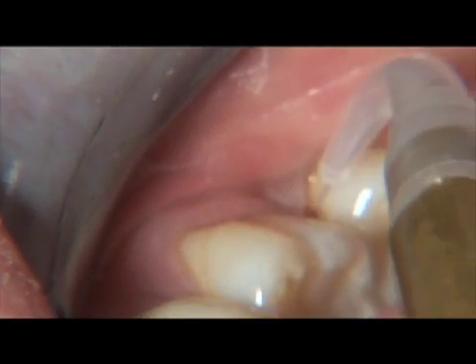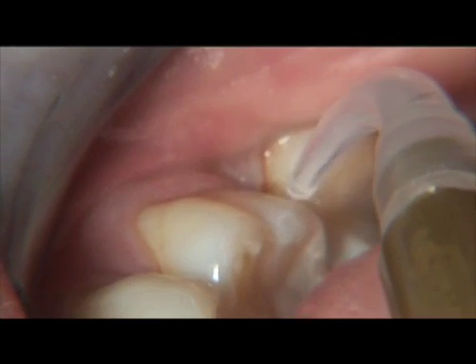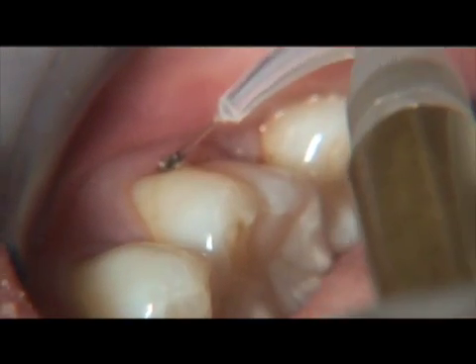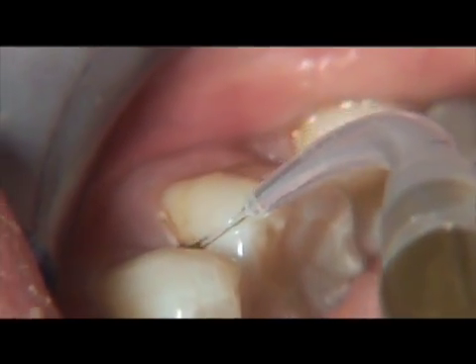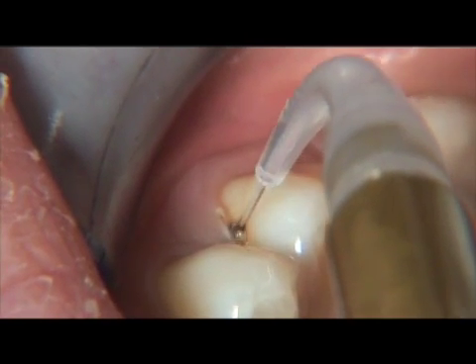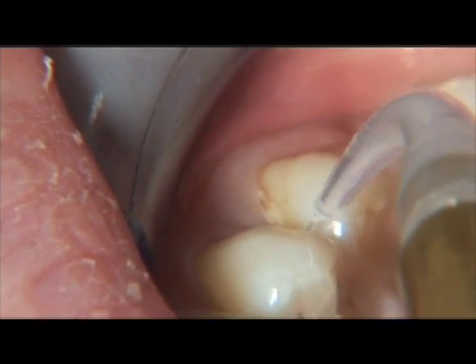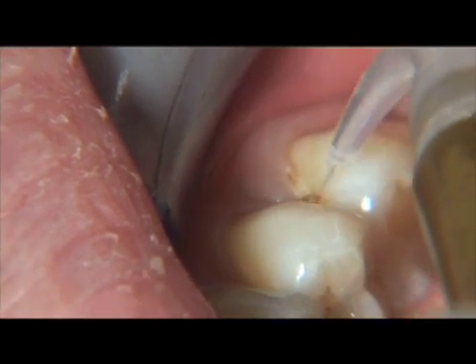The technique utilizes a light paintbrush stroke while moving the fiber from the base of the pocket to the coronal portion of the tooth. Make sure you are aiming the laser fiber toward the lining of the epithelium and not the root surface, as this technique will remove some of the diseased epithelium.